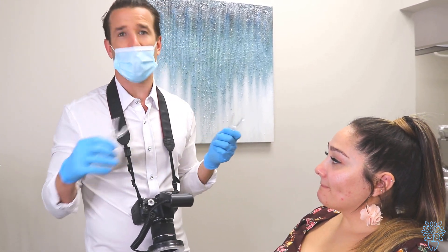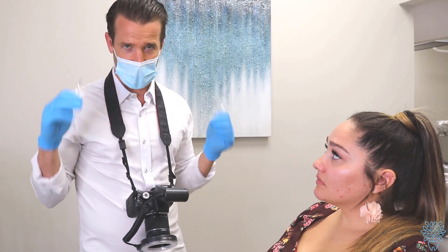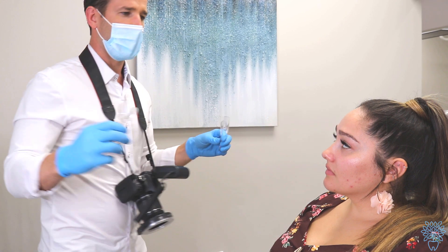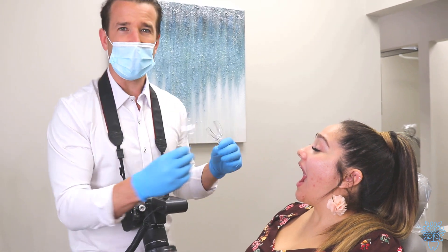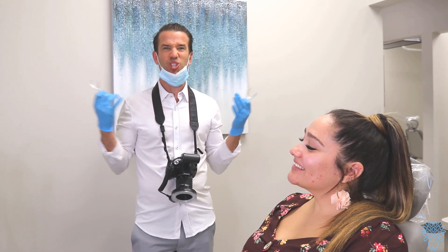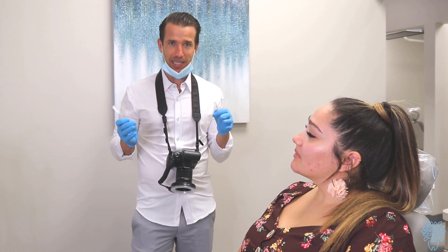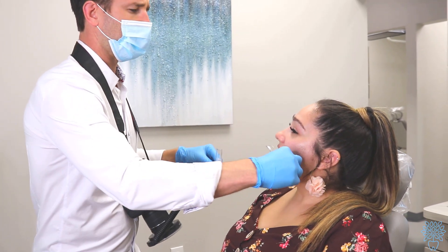I always talk to patients through everything I'm doing — taking pictures, X-rays, bonding. I'll say: 'I'm going to put these inside your mouth and spread them like this, so open just a little bit and tilt your head back slightly.' One trick: patients tend to open super wide, which is too tight. I'll say 'close it down just a little bit' and that makes life a lot easier.